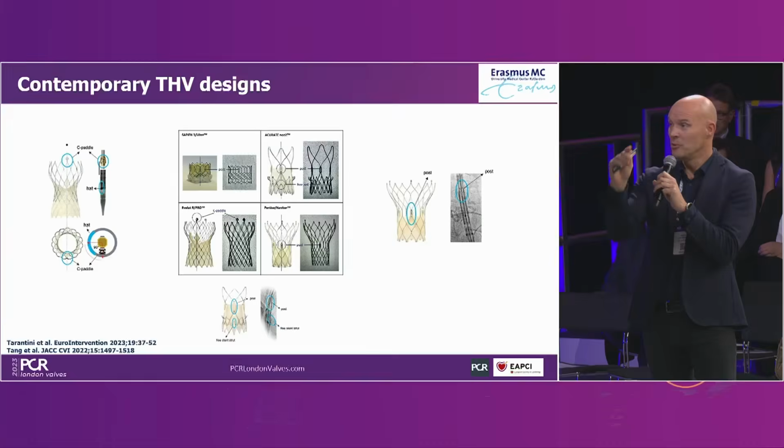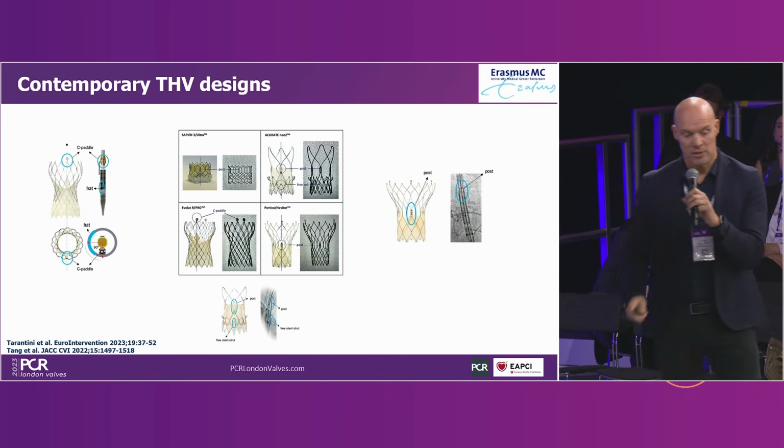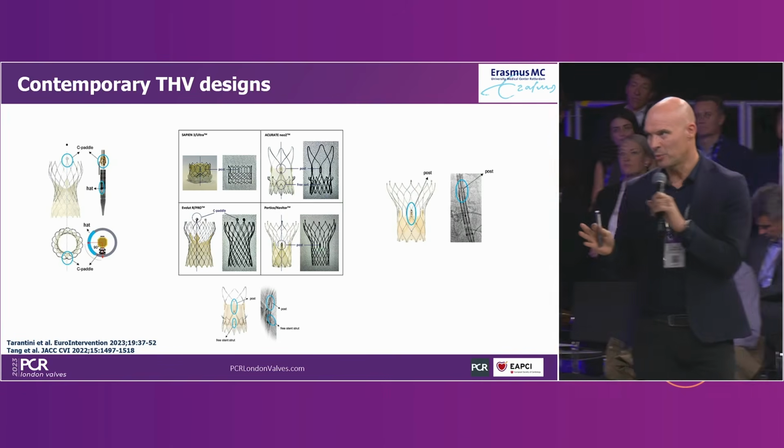Yes, many people. And that is also the interplay of the sinotubular junction and the sinus of Valsalva per se. If the sinotubular junction is also, in terms of dimensions, wide enough, you can even go on the outside, and then approach the coronaries. So it's always a holistic approach.